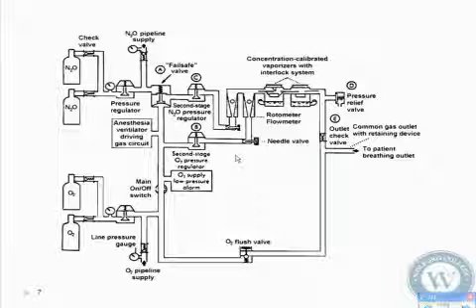Okay, then here's your vaporizers. So what gases are traveling through the vaporizers? Yeah, but what gases? Is it just oxygen, or is it oxygen and nitrous, just air, what?